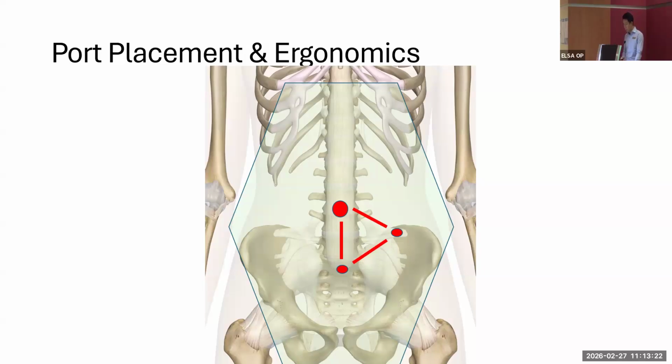This allows me to have access to the cecum, and you see there's no instrument clashing. I have access to the pelvis to perform a good washout. And with these ports, I can also perform a laparoscopic right hemicolectomy if that's called for.